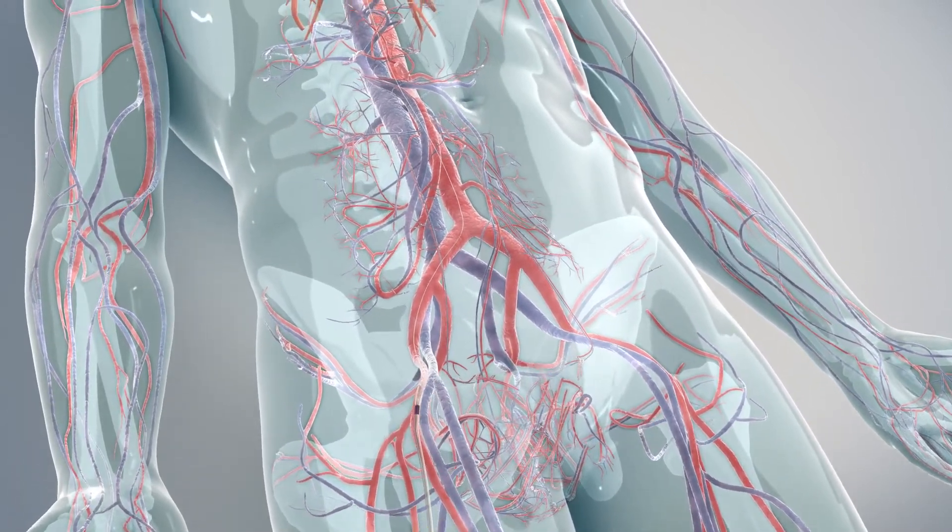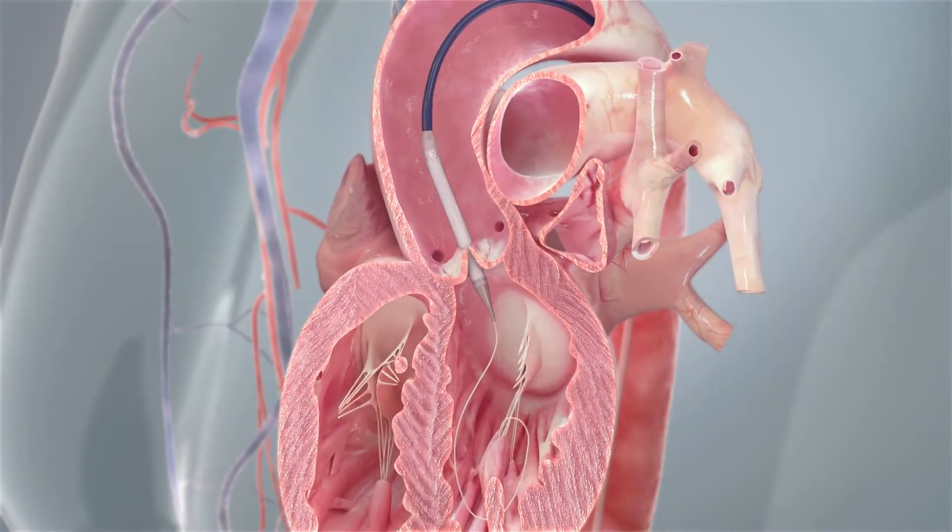This is an animation of it being passed through the leg, and I wish it was as quick and simple as that looks.